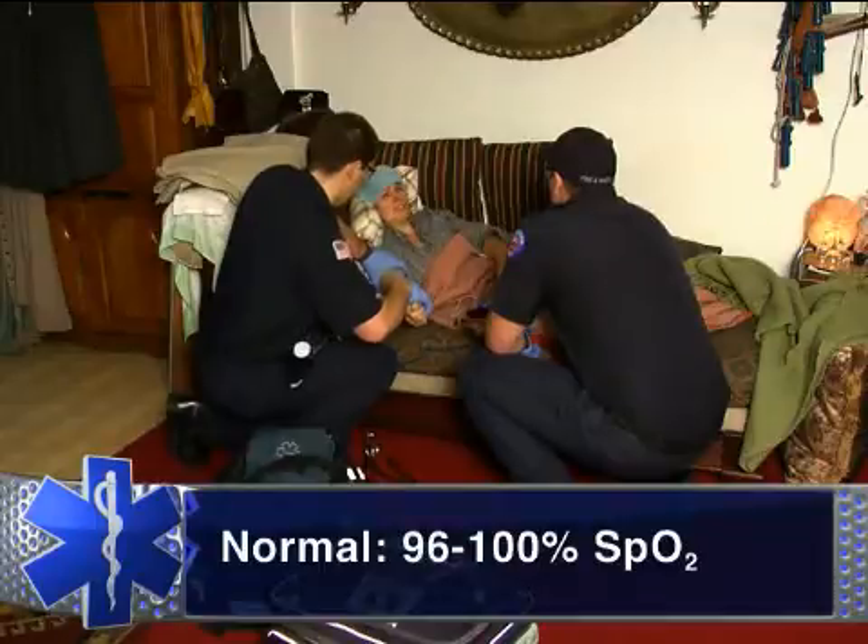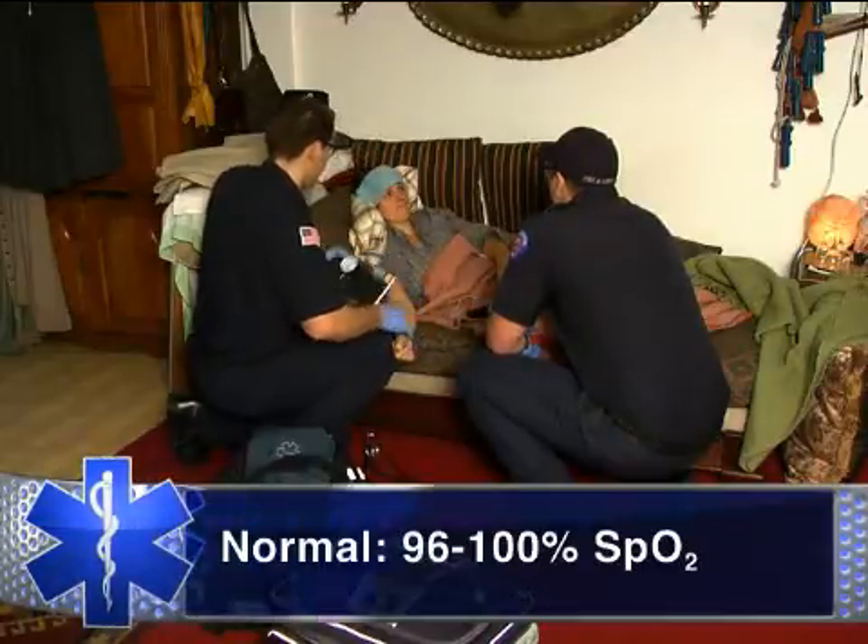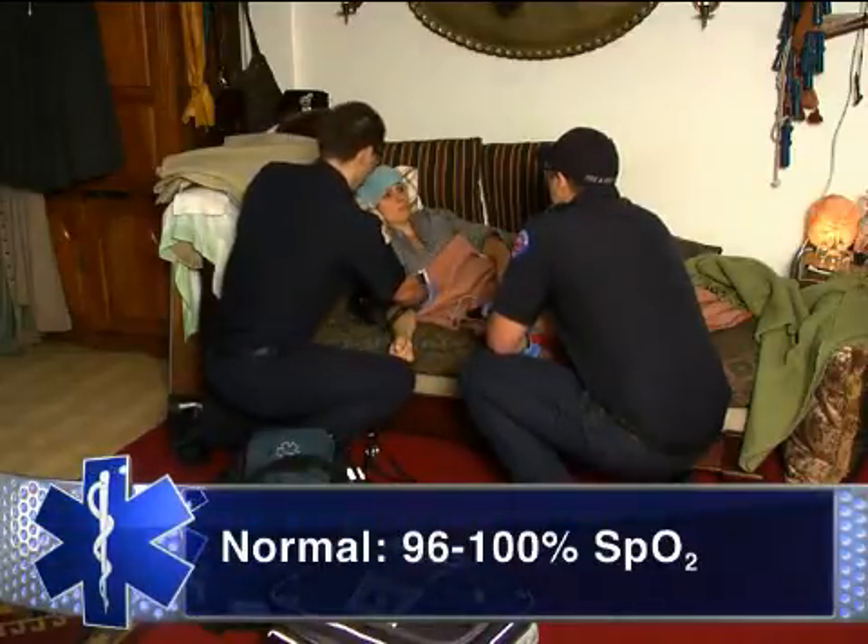When interpreting, expect a normal reading in a healthy person to be 96 to 100%.